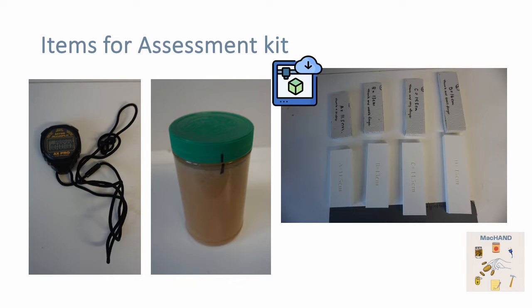So now we will do a quick list of the different items needed for this assessment. These items are everyday objects that can easily be found in Canada. If they are difficult to find in your country, the specific dimensions of each item can be found in the MPA Instruction and Scoring Manual PDFs, so you can find similar items.